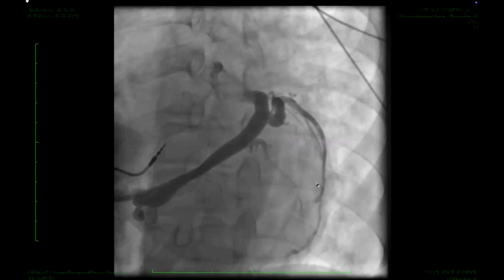Yeah, so both have their own challenges. The first branch, which is the smaller one, is actually looking quite small, and maybe the venogram, because it was an occlusion venogram, is not clearly showing us the size. But generally from this picture, it looks a bit small.